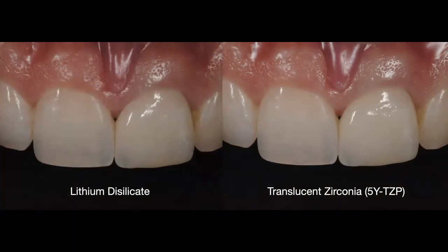He understands that, because now he understands why, by looking at all these photos, they understand this is not an easy case. And we're going to have to use a stump shade. We're going to have to fabricate a new restoration. We're going to have to modify the way that we are layering. All that has to happen.